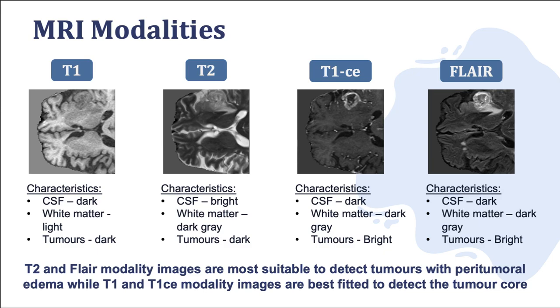Multimodal images are commonly used in medical imaging tasks such as image synthesis and segmentation. These multiple modalities provide brain information variability and information diversity, which aids in improving diagnosis and segmentation performance. This slide shows the 4 common modalities. In the images, you can see how the tumors show up differently in each modality, and the different tumor types are more distinct in each modality.